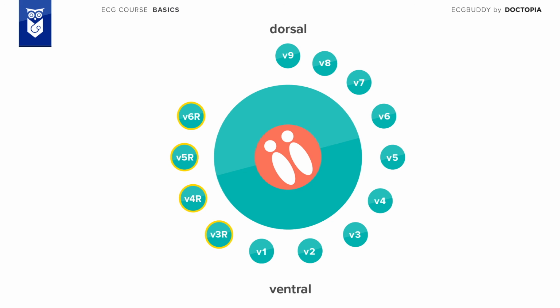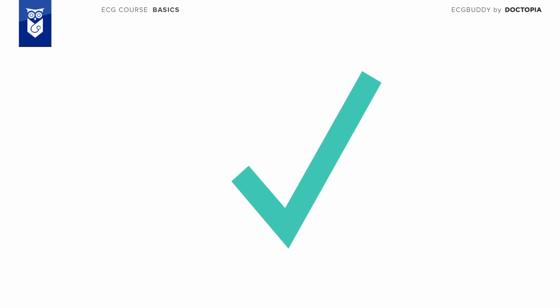The right cardiac leads are positioned on the right side of the chest, in positions that are analogous to those of the left precordial leads. This chapter has explained that ECG recording is effectively a short film about the heart conduction system in a given patient. It has also explained the ECG leads and how the ECG electrodes are placed. In this graph, the 12 standard ECG leads are shown in 3-dimensional space.